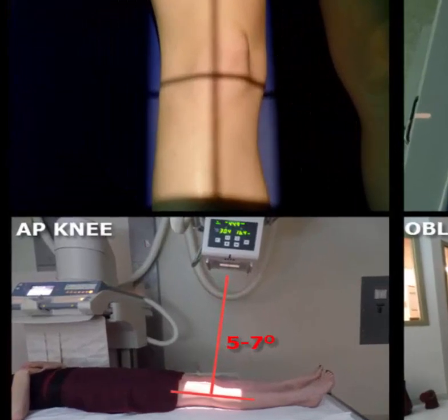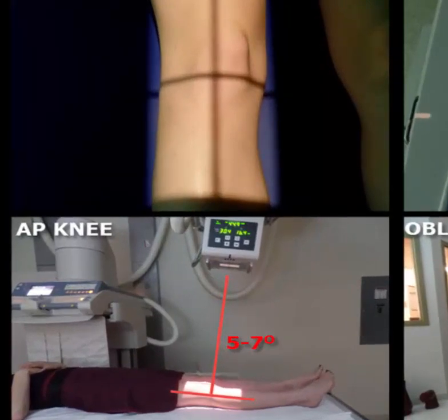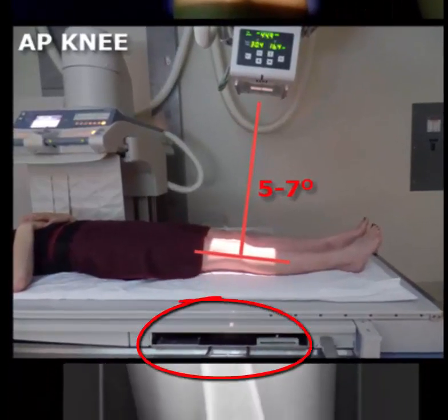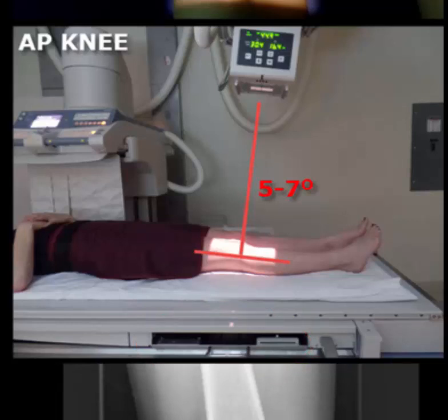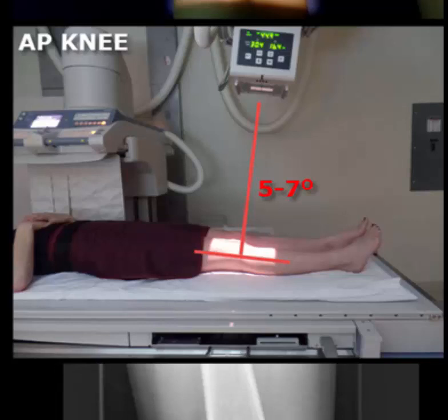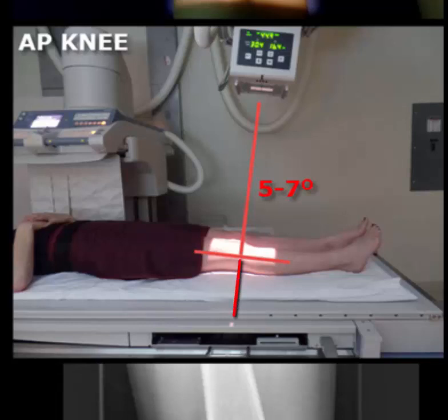First, let's start with the AP. You will want to have the patient lay down supine on the radiographic table. Next, move your table bucky to a location close to the level of the knee joint — this would be at the foot end of the table. Once you have the patient laying comfortably in the supine position, detent your x-ray tube, and apply a 5 to 7 degree cephalic angle. Once you've applied this angle, double check to ensure that your central ray matches up with your IR.